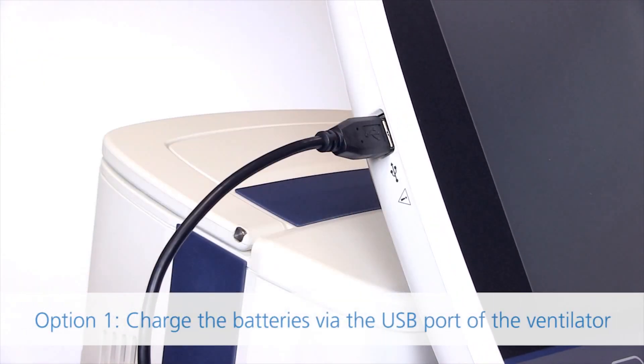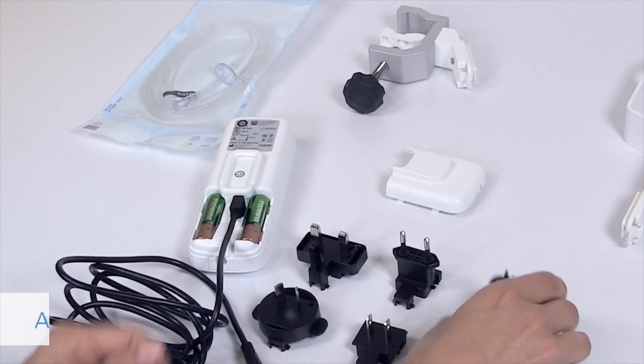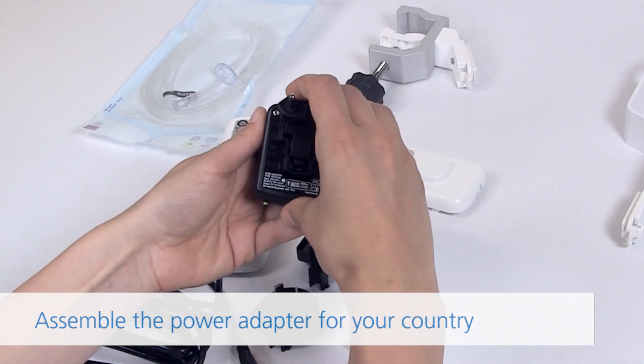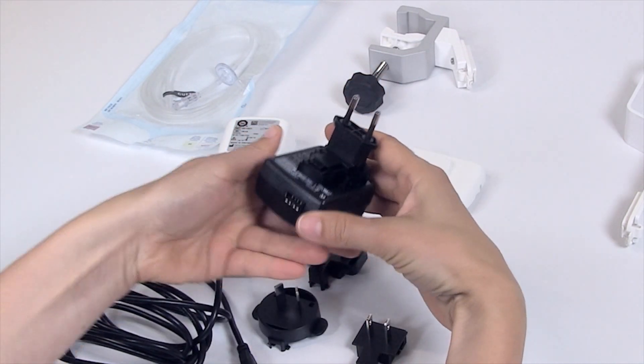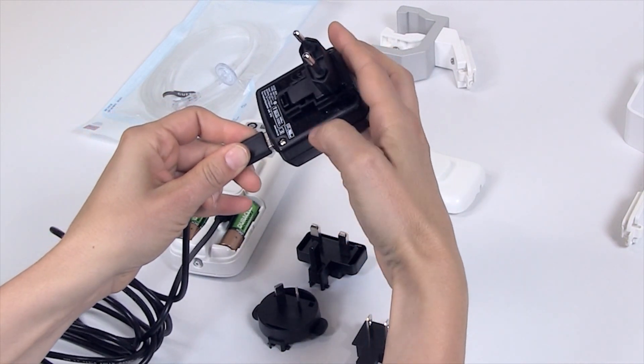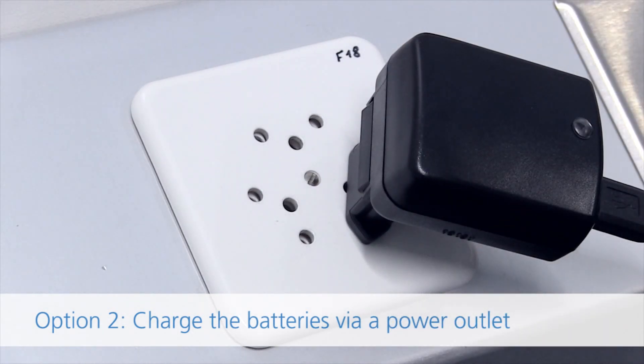Option 1: Charge the batteries via the USB port of the ventilator. Assemble the power adapter for your country. Option 2: Charge the batteries via a power outlet.